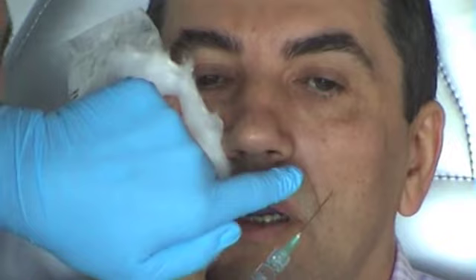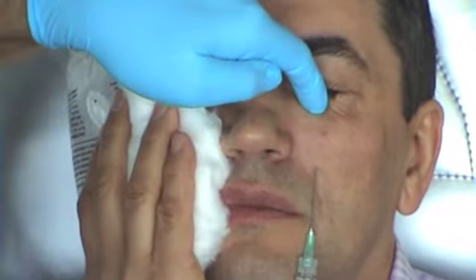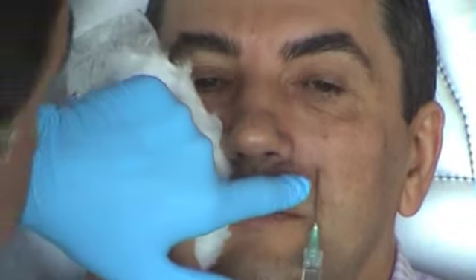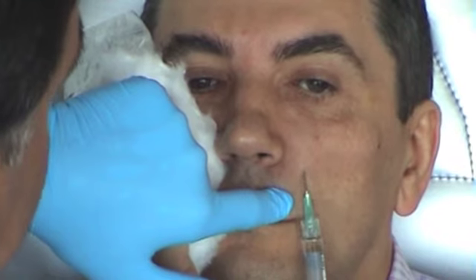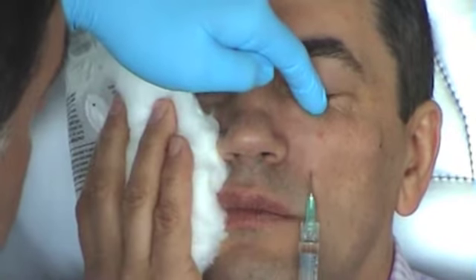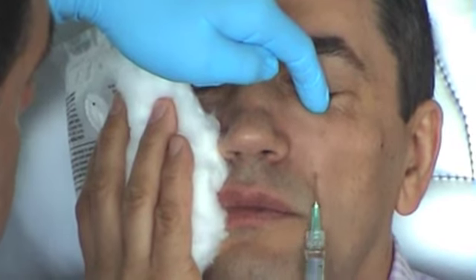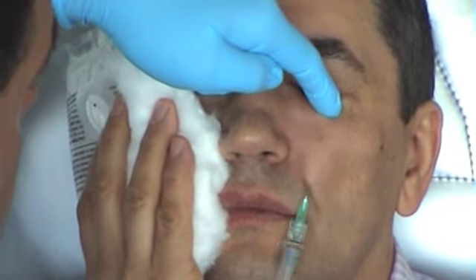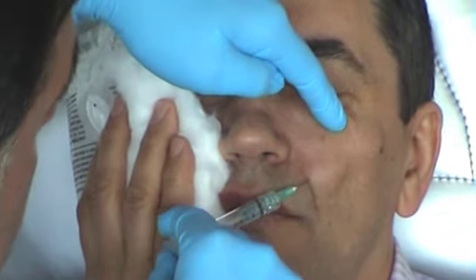I'm on the right side again to do the vertical injection. Orbital rim is here. You see here, I'm elevating the fat in the orbicularis muscle. You don't have to touch the bone, because every time you touch the bone it's more painful — it can be painful or it can cause bleeding.